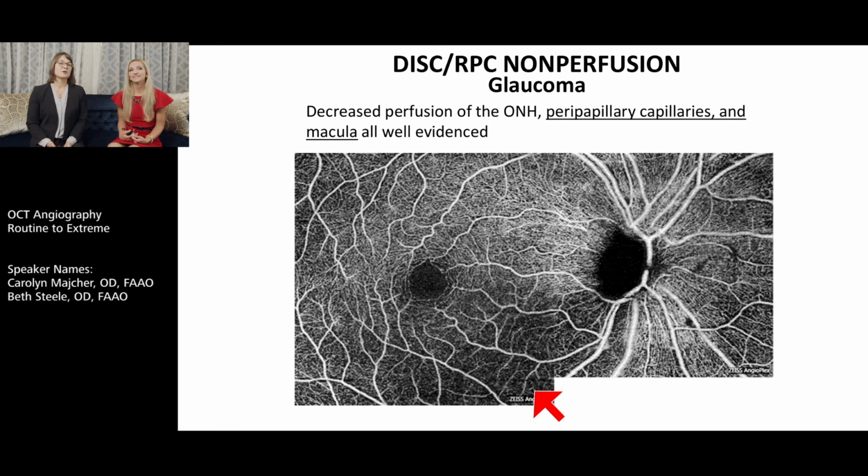We still have a lot to learn about what OCTA can do for us in the care of our glaucoma patients, whether it be early detection, better correlation of data, or just looking carefully for progression over time in a different way with different information, correlating all of those together: structure, function, vascular anatomy. But there's definitely strong evidence and a whole lot of potential in terms of what this technology is going to be doing for us in the future. So this is something we have to pay careful attention to in the near future.